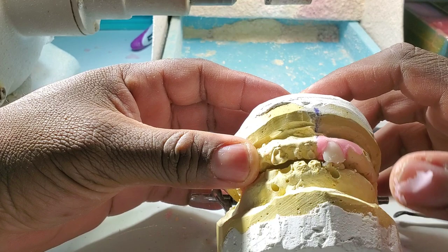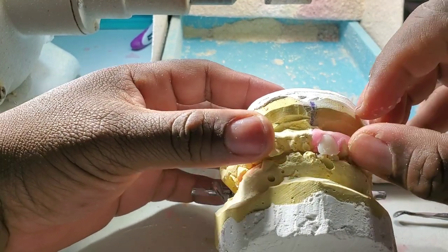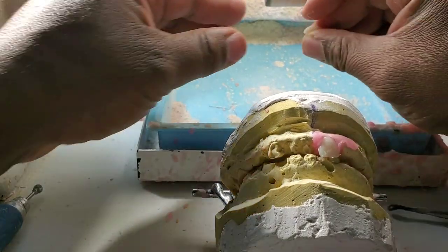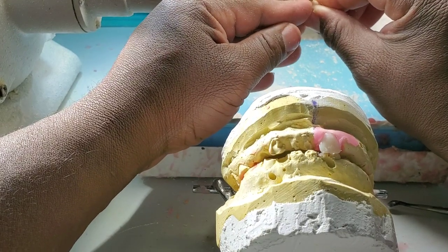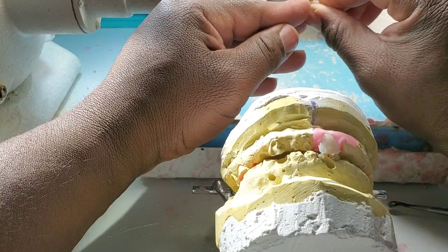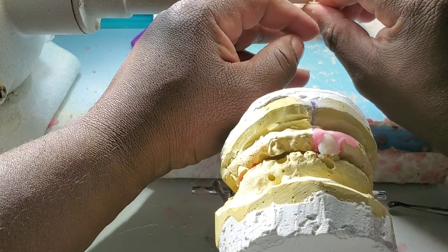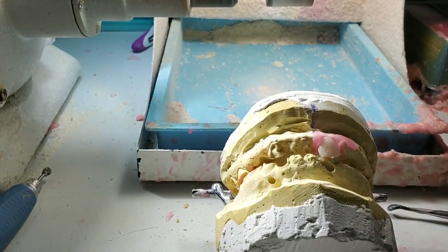Right now I'm putting the central in the zone where the central was located — right in the same area, right in the same spot. I still have to grind on the tooth and put it in the exact location where the broken one was. So immediate dentures are pretty much done that way.